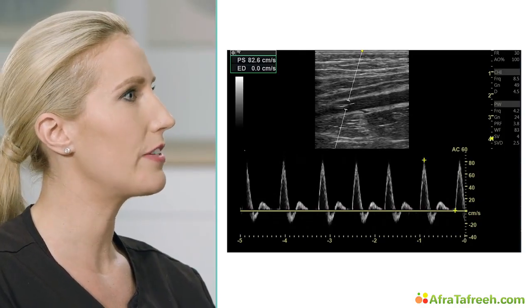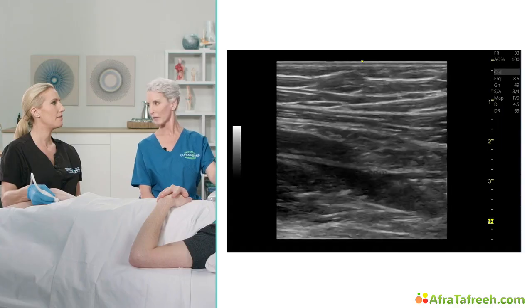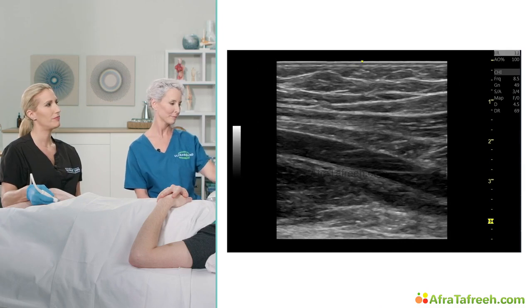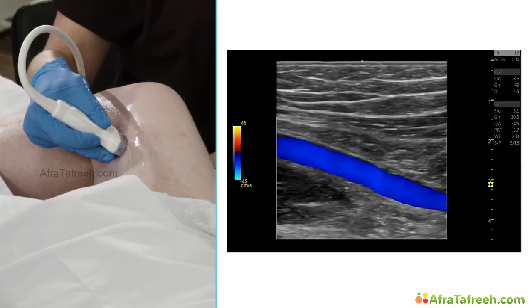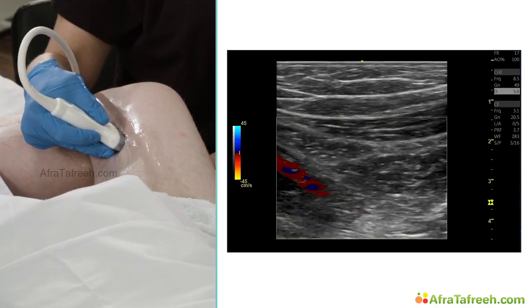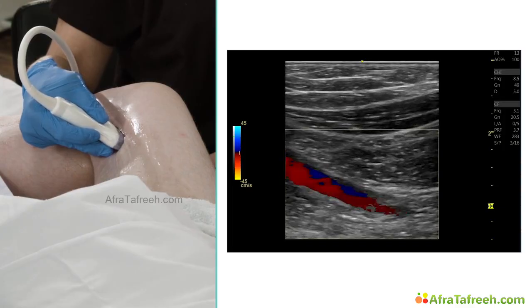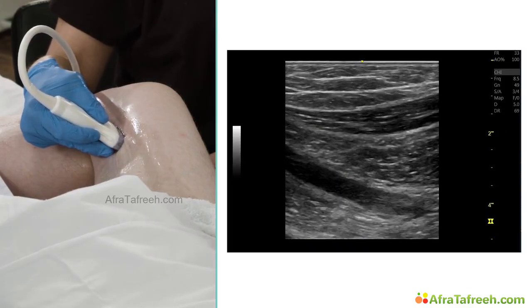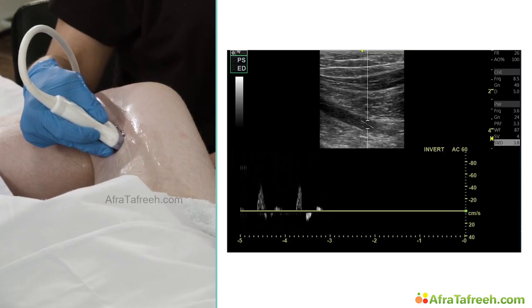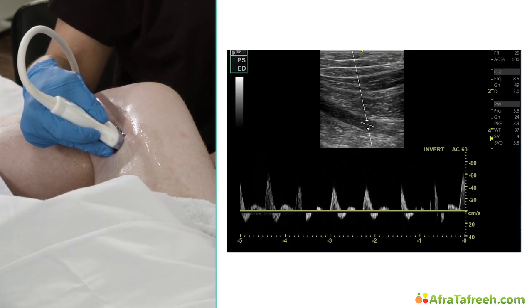All right, let's go ahead and get our distal one. Scroll down distally. Would you like some color to help? Sure. I'll center steer my box. Thank you. And I'll even invert the color so that we have our arteries red. I like that. And I'll turn the color off. Beautiful. And I'll sample. All right, let's make sure we beam steer that appropriately. There we go. Nice job.